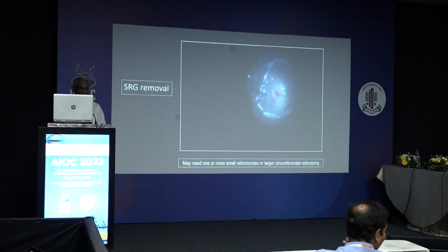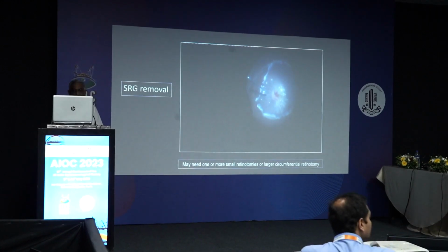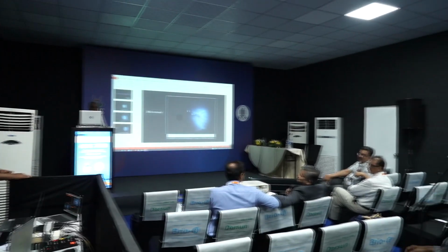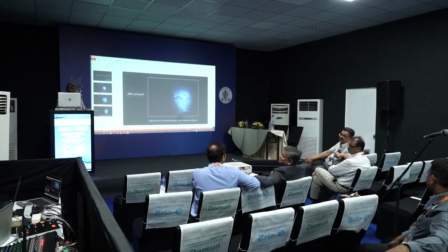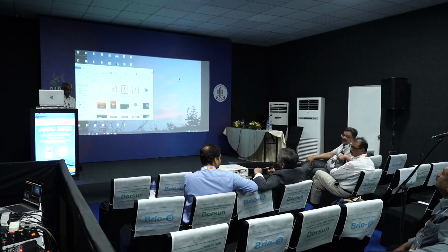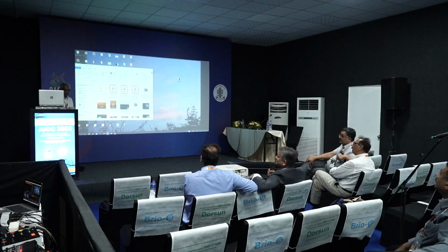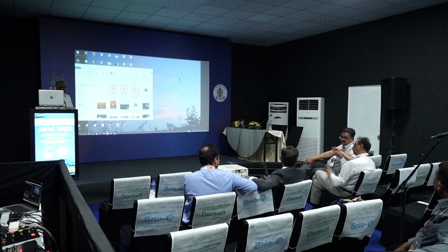The endoscopy man is sitting next to you; he can answer the question. No forceps can be put along with the endoscope, you need another instrument. What you can do is make an opening in the retina, go through with the endoscope through one port, and then you need another port for the forceps. That you can do.